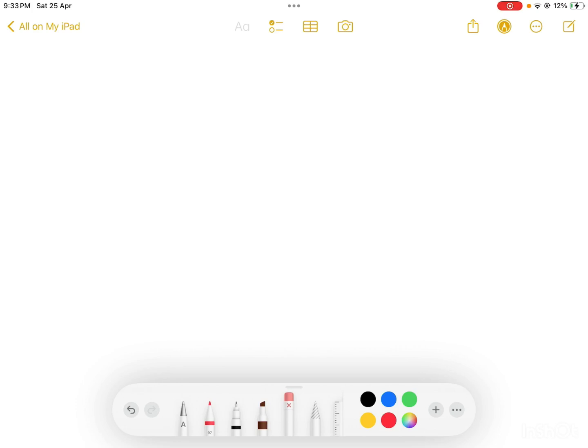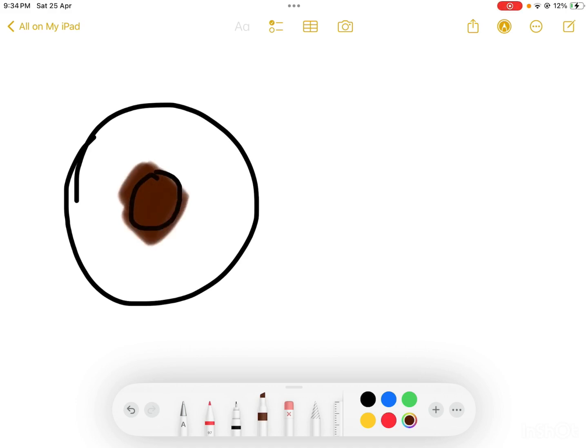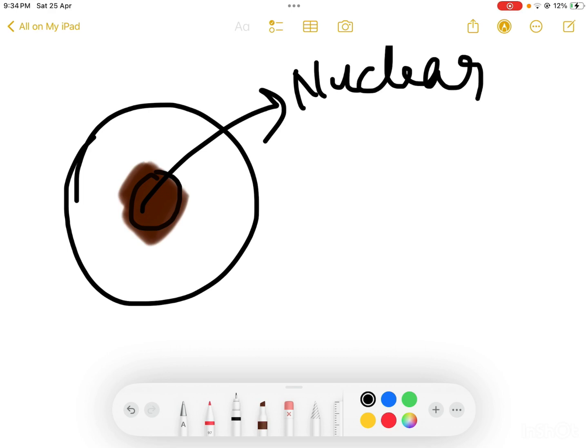So if you imagine, okay, this is the cell, and this is the nucleus. Now what are the basic IHC patterns that you get? First pattern is the nuclear pattern. Okay, so you know that we are putting antibodies against the protein. So what are the IHCs that will be positive in the nucleus? Against the proteins that are already present in the nucleus. So what are the IHCs that give you a nuclear pattern of staining?